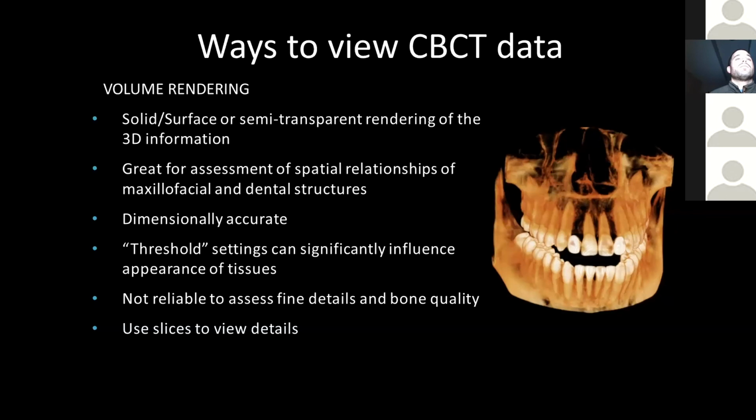So keep all those variables in mind when you look at an airway dimension and account for that clinically. Now, it's not to say it's not a useful tool. You just have to use it properly and understand its limitations. Personally, I have a threshold where if an airway appears significantly constricted, specifically in the lateral dimensions, I will note that as a possible risk factor for sleep apnea. It is not a diagnosis of them having sleep apnea. And ultimately, that diagnosis comes from a true sleep study.